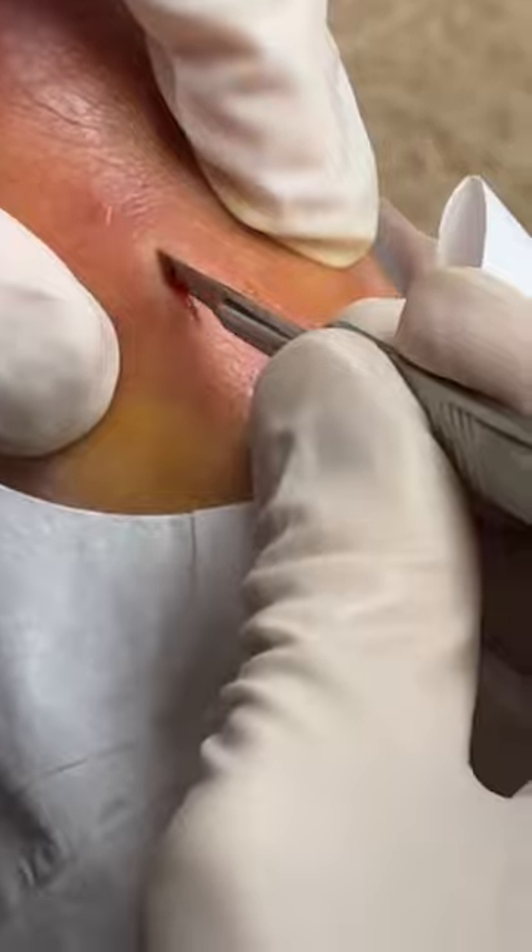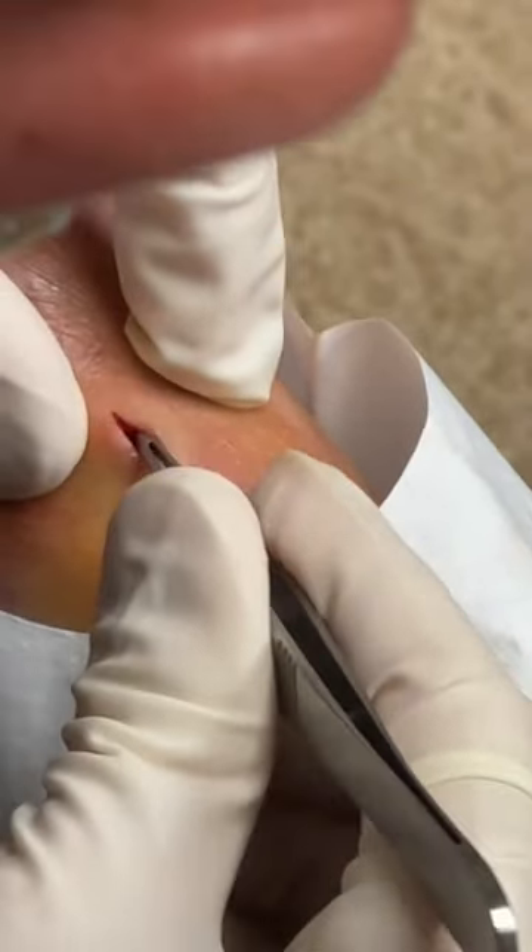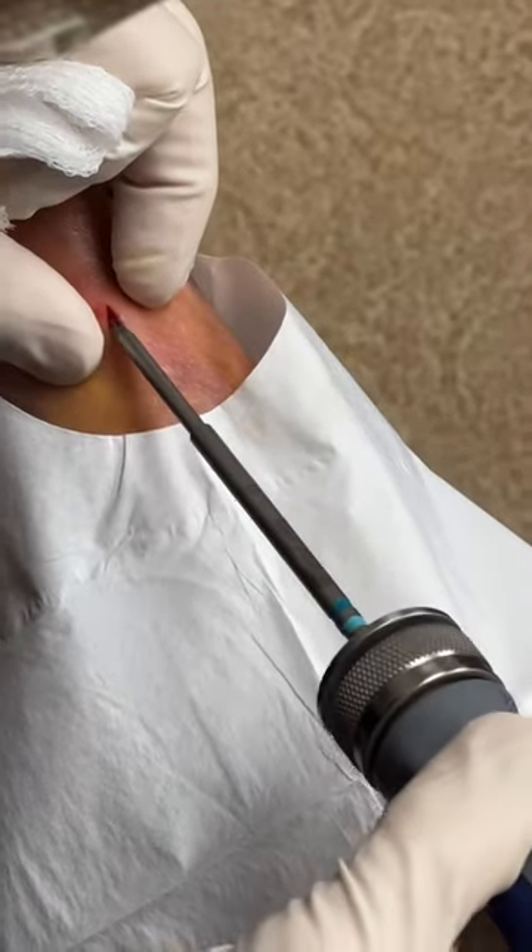You can see we're making a small incision with a scalpel. We're going in, finding the screw, palpating it with our tweezers, and then inserting our instrument to get the screw out. When we insert the screwdriver at first, we can't find the screw.